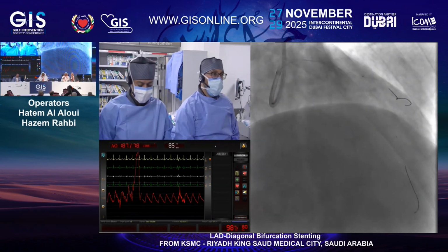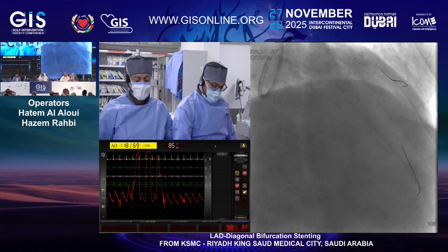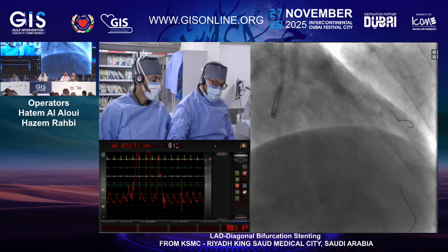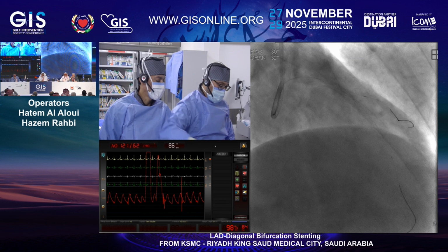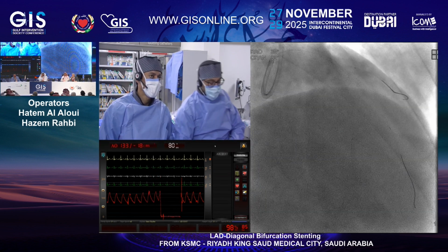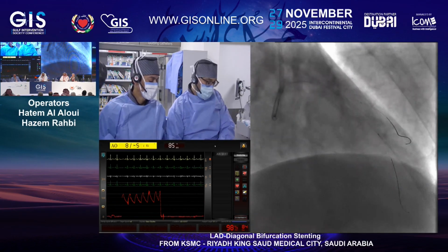We're going to see now. Prepare the 408 and see. The stent was deployed at what pressure? 12. The vessel is 3.5, so we went just nominal. And now we will put the 408.